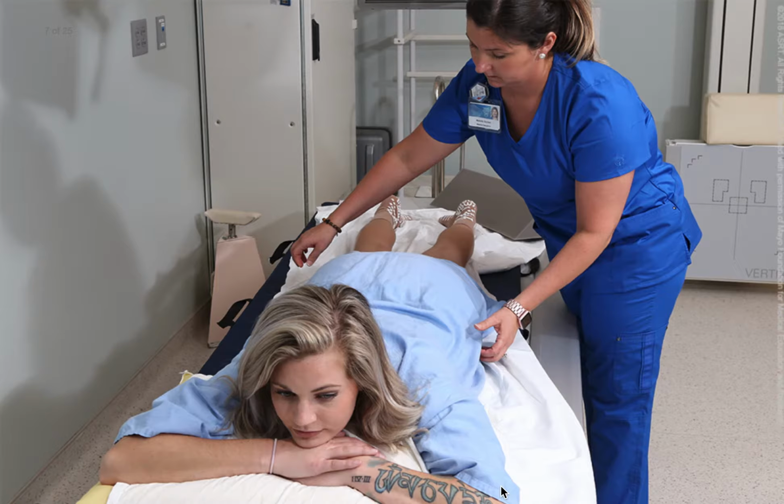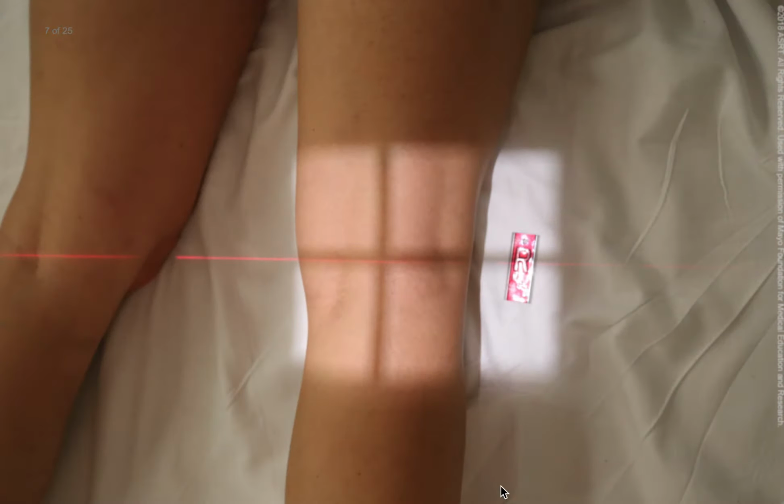Rotate the patient's leg and heel slightly until the patella is parallel with the plane of the image receptor, typically 5 to 10 degrees laterally. The central ray is directed perpendicularly to the mid-popliteal area and exits through the patella. Anatomical markers are placed on the image receptor to identify the anatomical side that is being examined. The patient's gonads are shielded, and the shield is placed between the X-ray source and the patient. Instruct the patient to hold very still, but no breathing instructions are necessary.